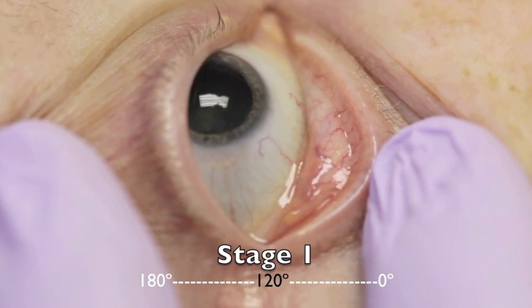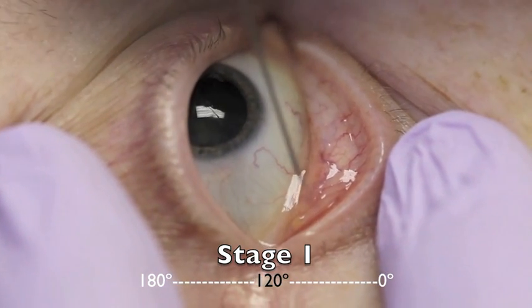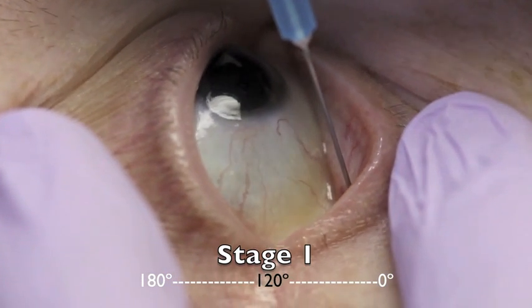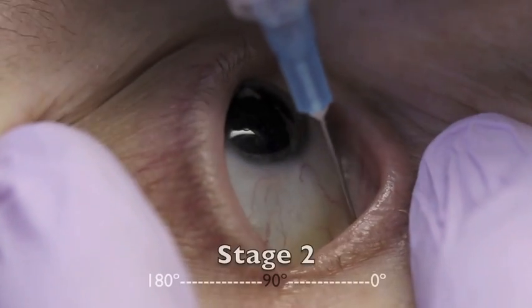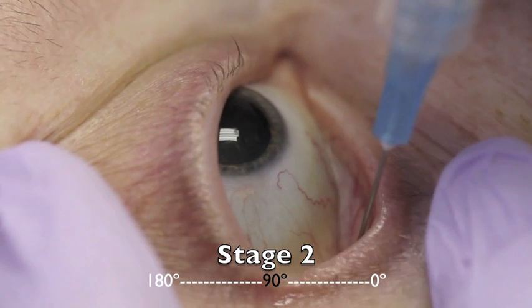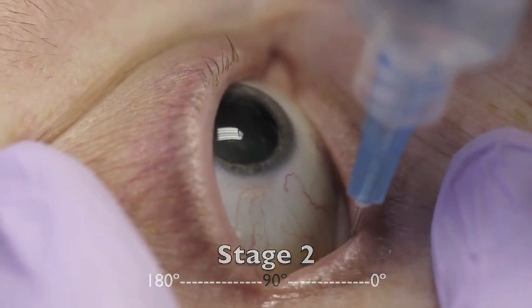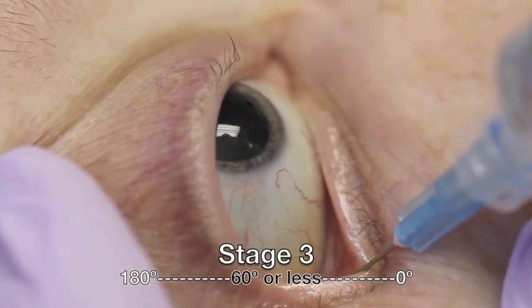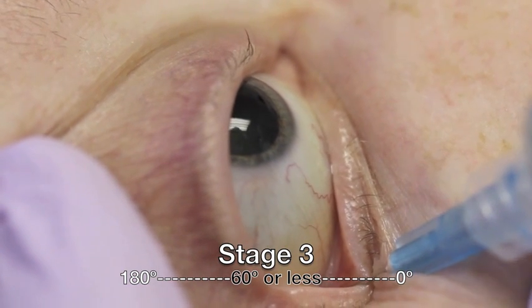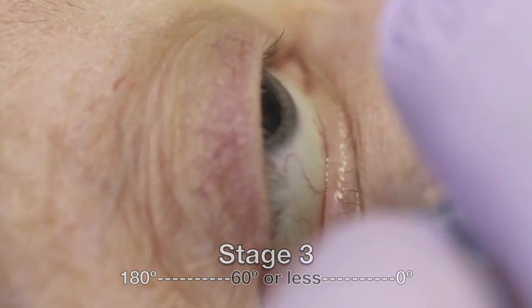Stage 1. Insert the needle tip with the bevel towards the globe 2 millimeters lateral to the limbus and 2 millimeters inferior to the globe at 120 degrees toward the orbital floor, approximately 2 millimeters. Stage 2. Redirect 90 degrees. Slowly advance the needle tip posterior half an inch, passing the equatorial plane of the globe in the extraconal space. Stage 3. Rotate the needle tip cephalad until the shaft of the needle rests on the infraorbital rim. Then slowly advance the needle tip into the intraconal space to a depth of approximately 1 inch.